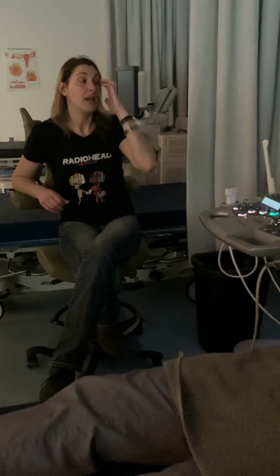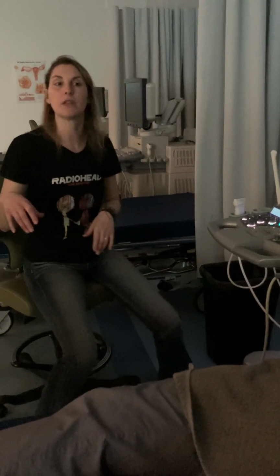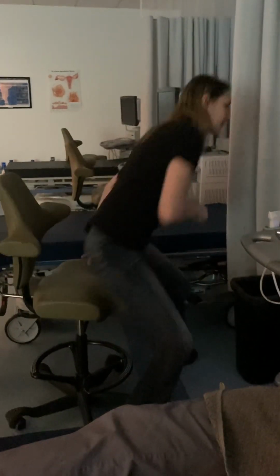But anyway, so that's your basic prostate protocol. And again, unless you see anything abnormal, no color, we just measure in 3 planes, so with and without calipers. So go ahead and take a few minutes, and then once you guys have all tried the prostate thing, I'll sit down on the machine with the male pelvis and we'll talk through scrotum.